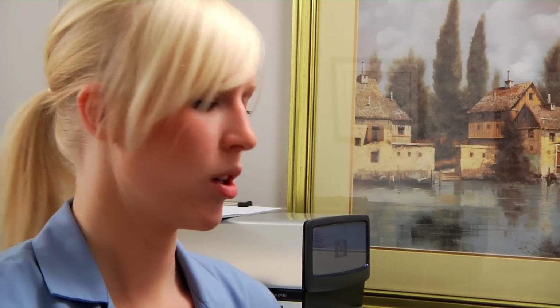Tell them, I'm going to put the blood pressure cuff on you, leave the room for a few minutes, turn the lights out. I want you to relax, breathe deeply, keep your legs uncrossed. Those are 3 very important things that the patient really needs to do in order to make sure their blood pressure is a nice resting blood pressure.